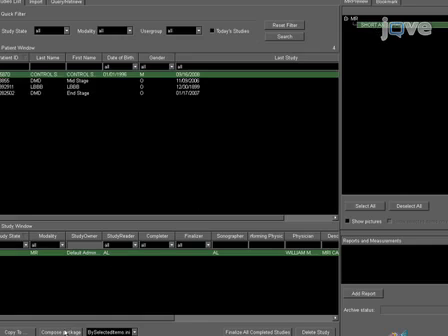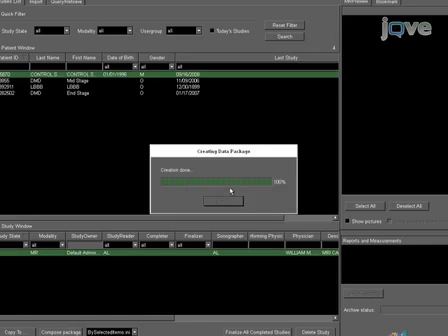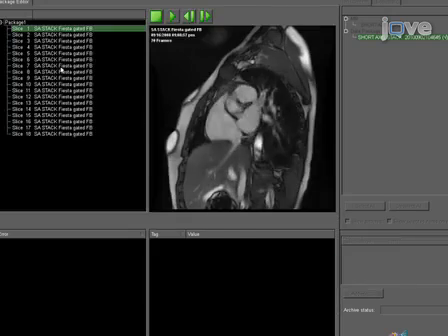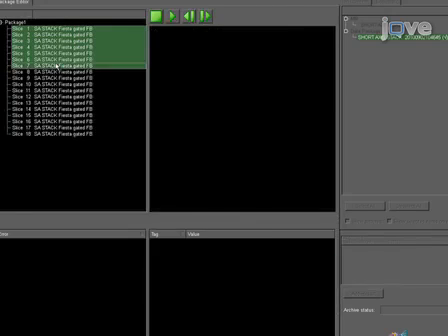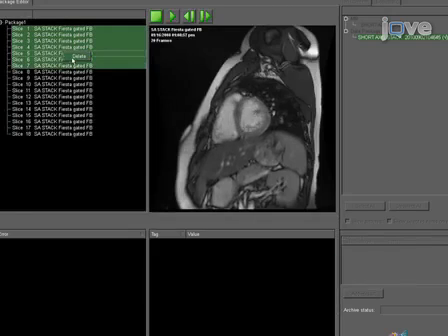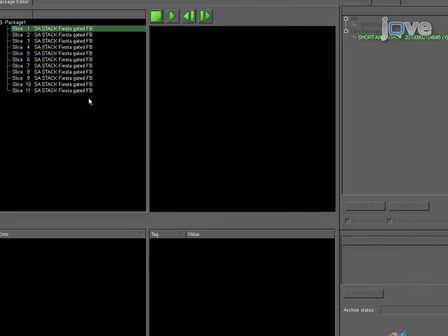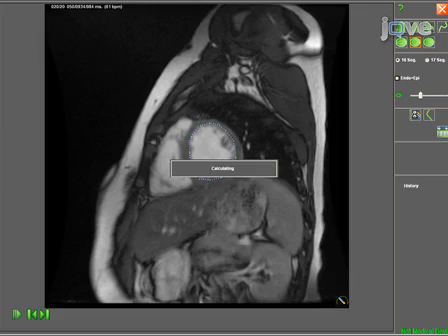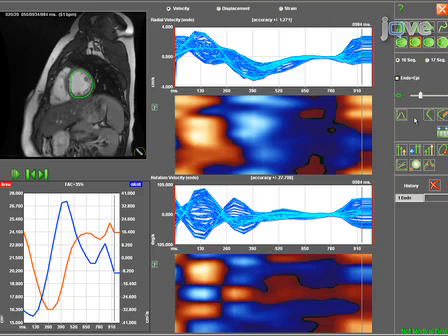First, a standard cardiac MRI short axis sequence is acquired. The cardiac MRI short axis CINE sequence is then downloaded into the feature tracking software, and a data package is composed for strain analysis. After tracing an initial endocardial border at the end diastolic phase, the feature tracking software will automatically track the displacement of individual patterns representing anatomical structures throughout the entire cardiac cycle.